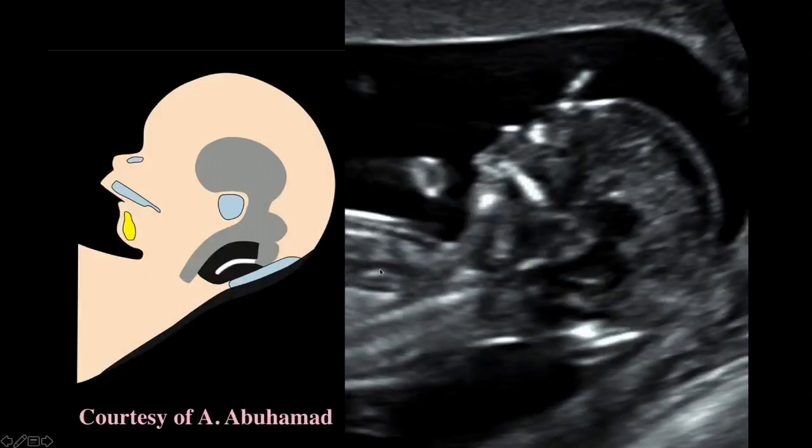Here is a small chin, you can see right here. And I think that rather than trying to measure things, I just eyeball it. I mean, this chin looks small. And here you're in the first trimester. If you're not sure, bring them back. But I think that this fetus looks like it has an overbite. And that's basically something that even if you change your orientation and your angle onto the fetus, you will not be able to rectify that. And that's basically how I make the diagnosis.